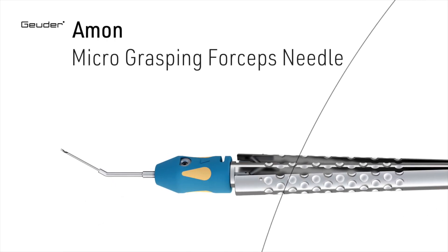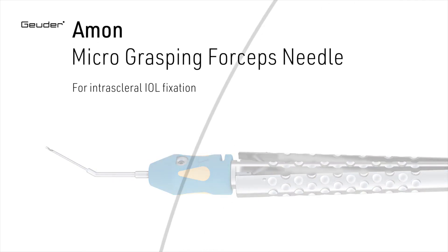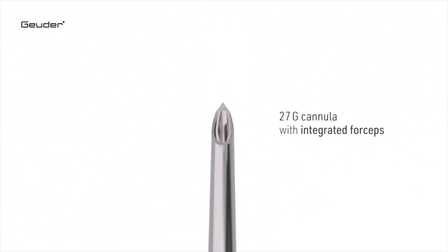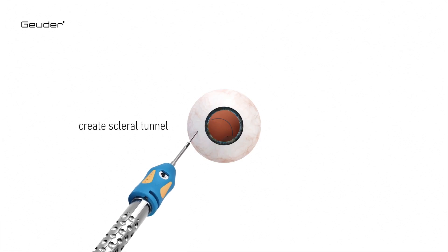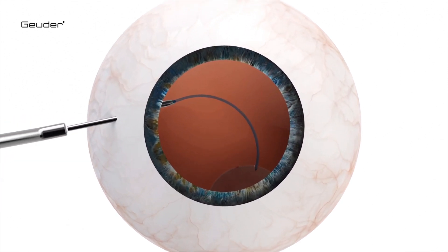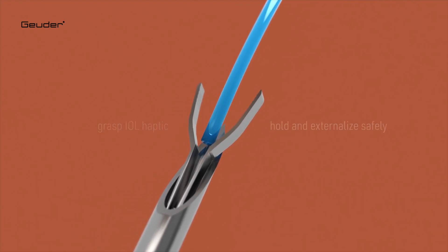It's the so-called forceps needle. It's an instrument combining a needle with a forceps inside the hollow needle. With all these flanging techniques nowadays — with flanged sutures, flanged haptics — we need to externalize material. With that needle, it is easier to perform because the needle holds the material inside, the forceps holds it, and then you easily can externalize it, no matter which angle you have between needle and haptic or suture.